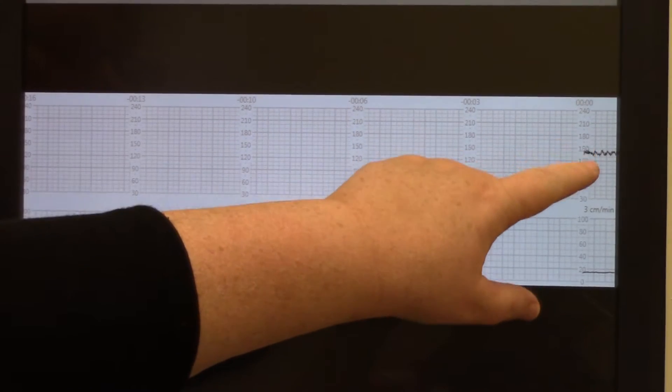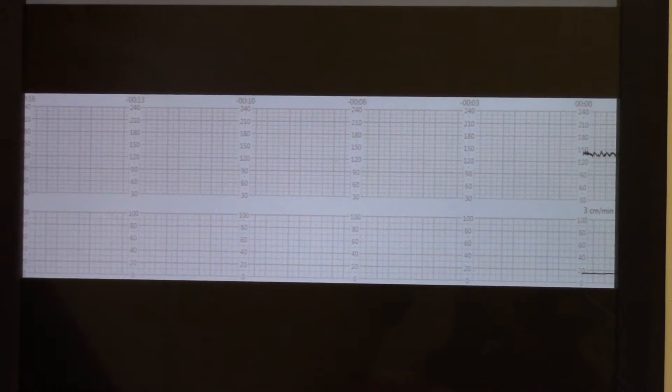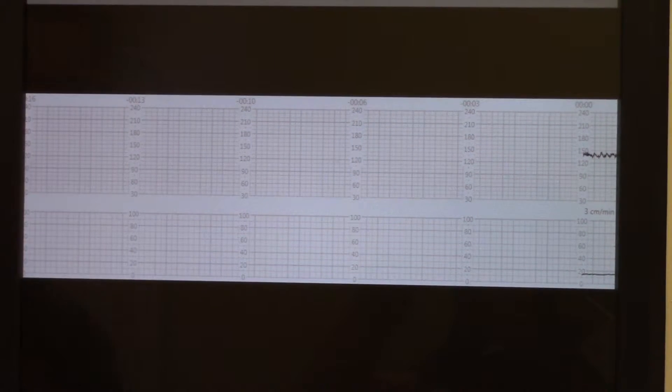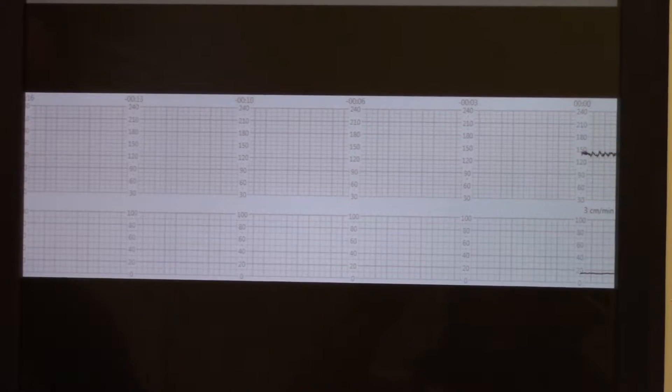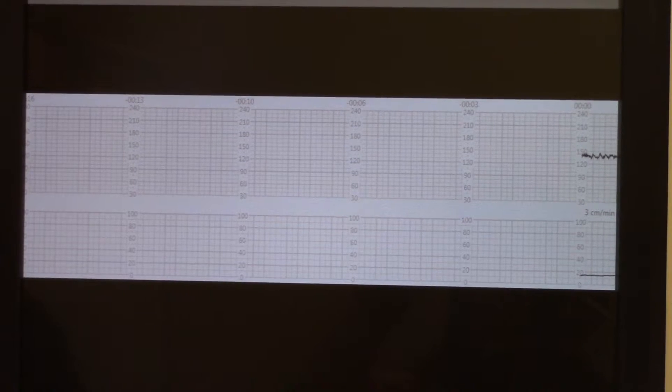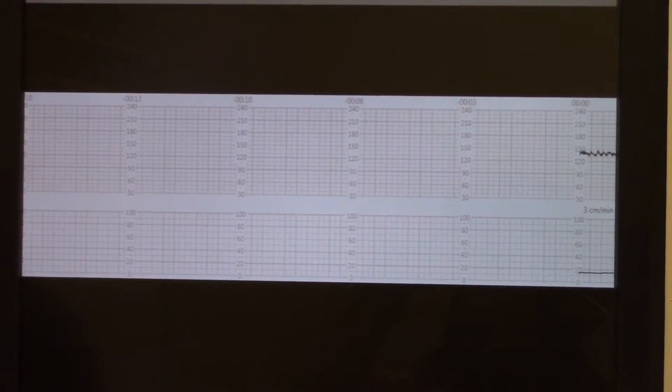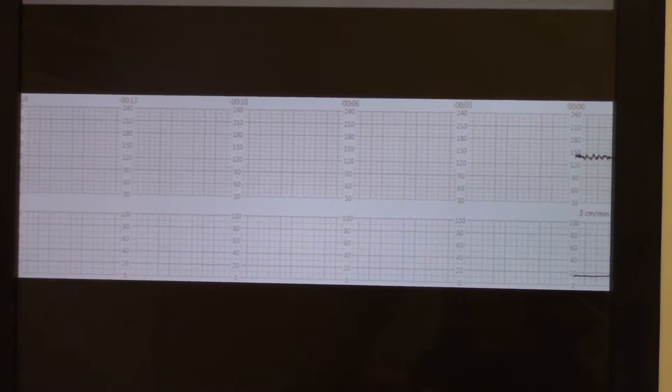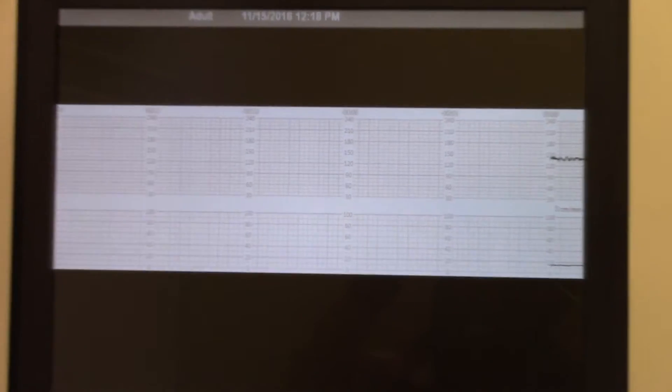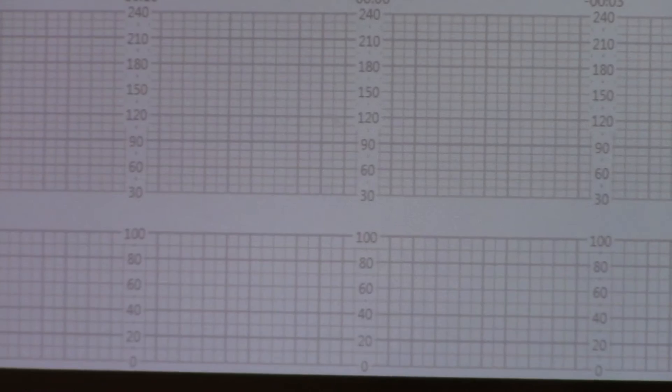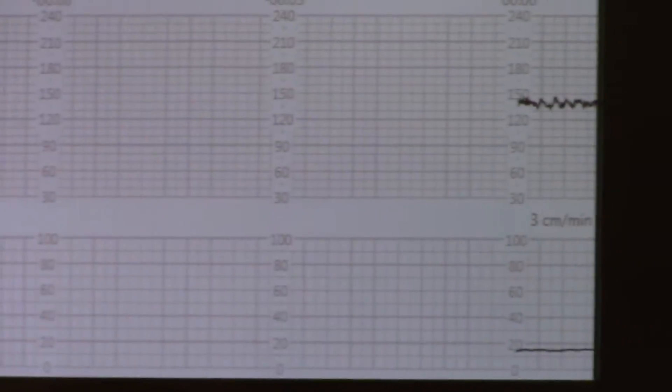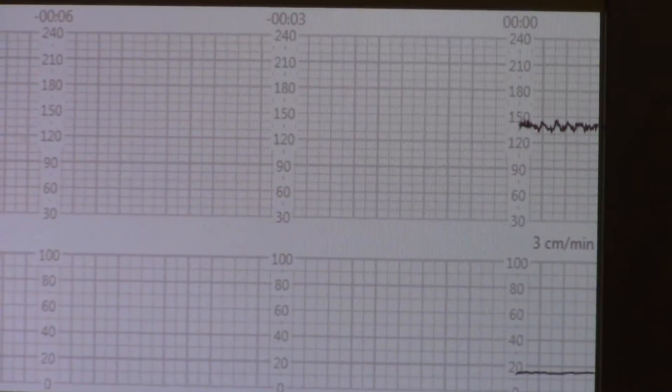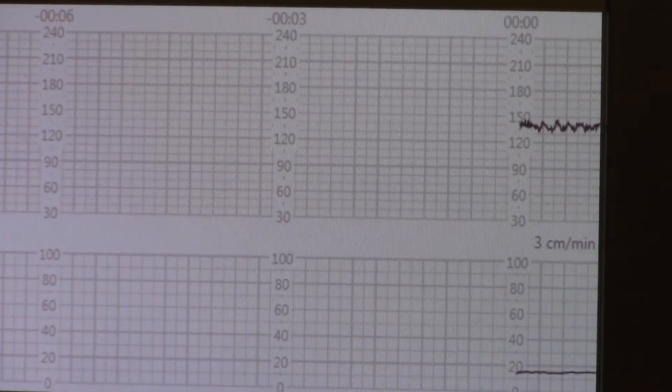We can see our heart rate's in the 140s. We can already see that there's average variability because you can see that there's at least 6 to 25 beats of variance between the beats. We're going to watch it for just a minute and see if we have any accelerations.